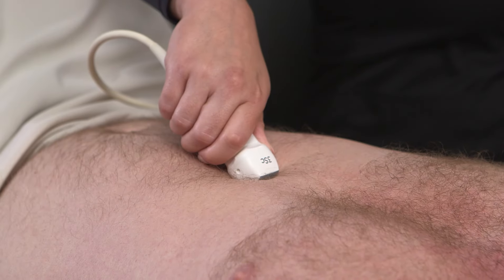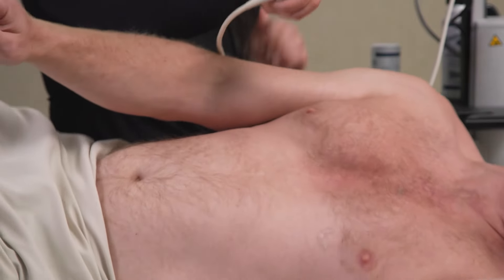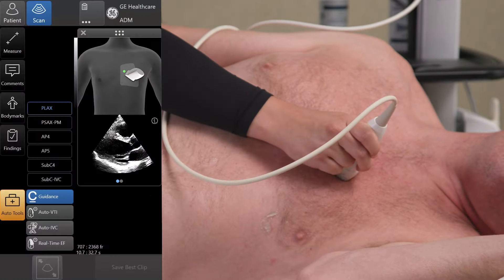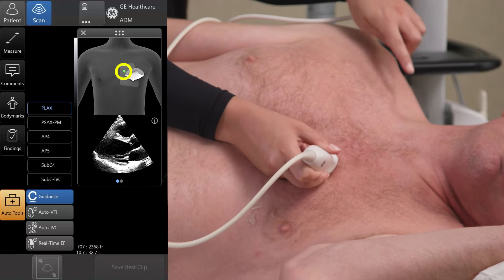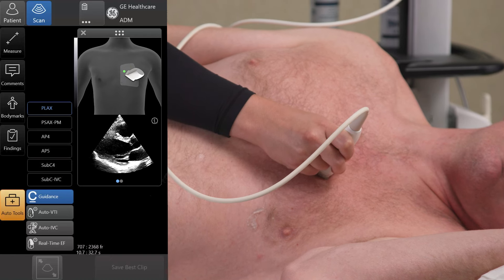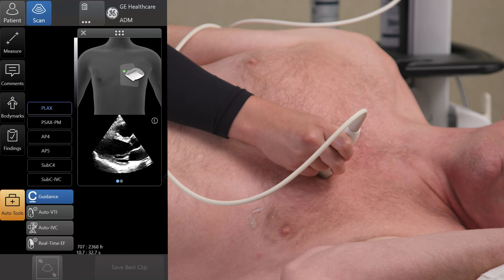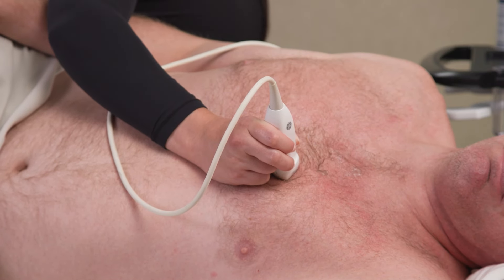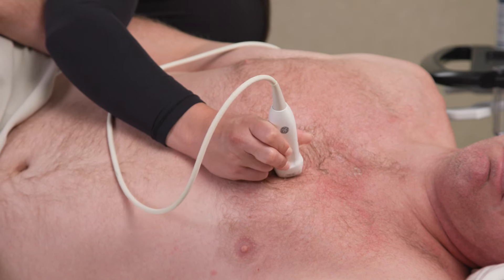With the proper hold on the probe and your indicator located, you can start scanning. Point your indicator as directed by the guidance software. In this example, you can see that the static guidance is informing you to point your indicator towards the patient's right shoulder. Notice that I am not changing the grip on the probe. As I continue to scan and need to make fine movements, I will plant the side of my hand to prevent sliding and to give me more control to make fine movements while trying to optimize the image.